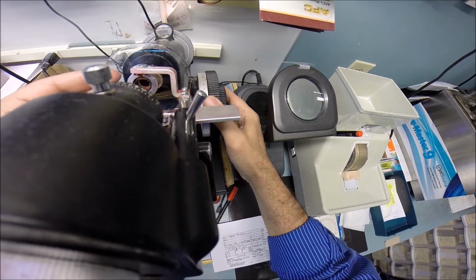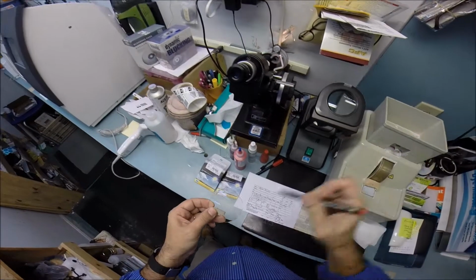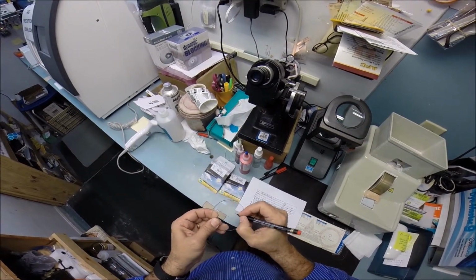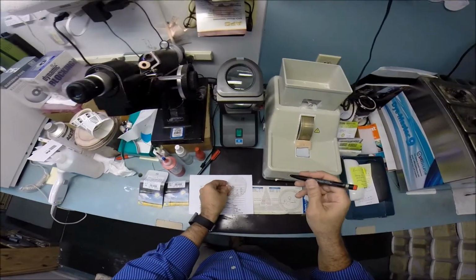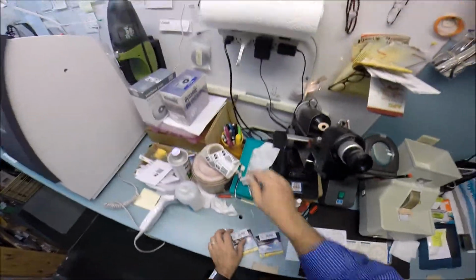I rotate your lens now to check your astigmatism correction, and now I'm going to put 3 dots on your lenses. The first 2 are good. Let me use my pen to darken the third. There we go. And this is your right lens. I will mark R.